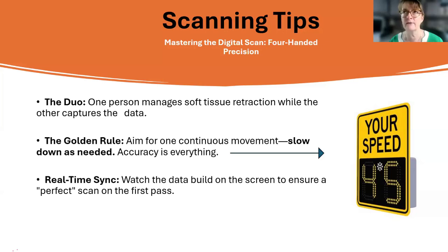Right. And so if I recall correctly, there's no post-processing that needs to occur to see that real-time scan. It is what you see on the screen. Is that correct? That is 100% correct. Got it.